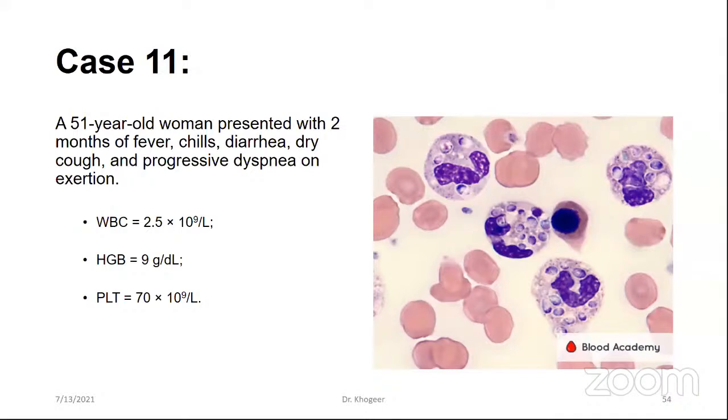What is the best area of the smear to detect cell inclusions? Again, the best area for peripheral blood examination is the body of the slide. But if you find your evaluation is sufficient by reviewing the body of the slide, there is no need to go to the tail or the head.